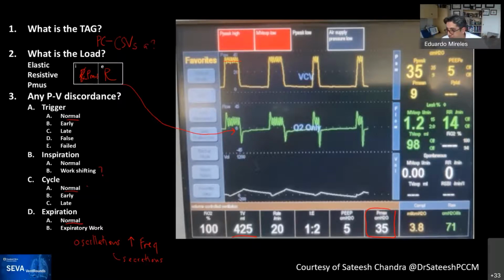So there's a question here. Does that vent have a floating exhalation valve? Do you know, Rob? Like I said, I'm not sure what ventilator that is. Yeah, I think it's an Engstrom. Satish told us. But that doesn't tell us anything. Like I said, Engstrom is an ancient name. It's been around for many decades. And as far as I know, there's no ventilator marketed called an Engstrom anymore.